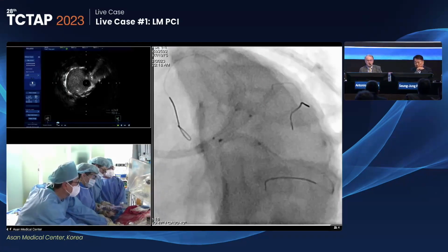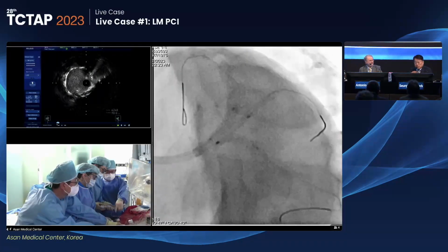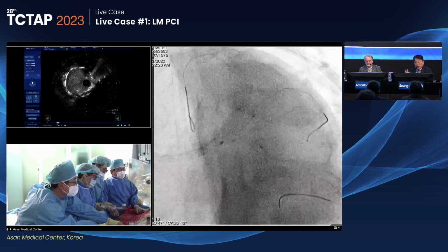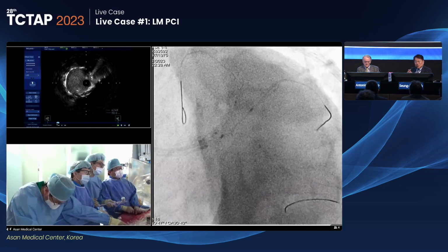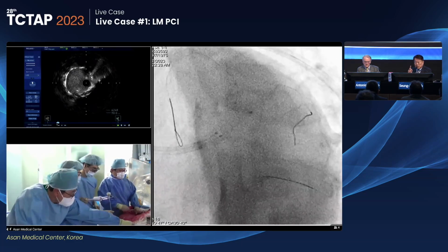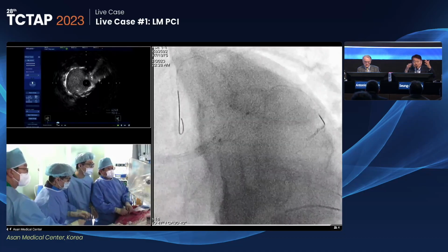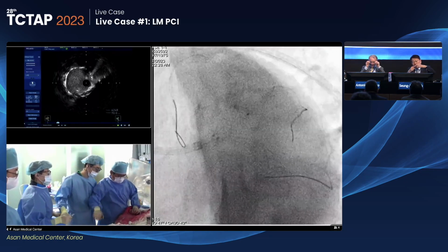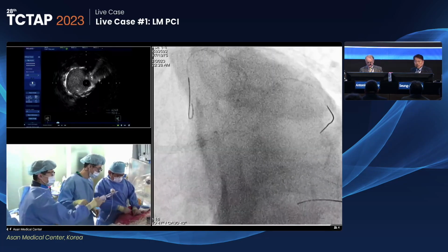So, in fact, based on our data, upfront 2 stent for LAD diagonals, any epicardial artery branches, upfront 2 stent, including the main upfront stent, is very good. The main focus is effective stent area. After any kind of 2 stent technique, whatever you use, finally, effective stent area is more than 5 at least. It's good, perfect. That is our data.